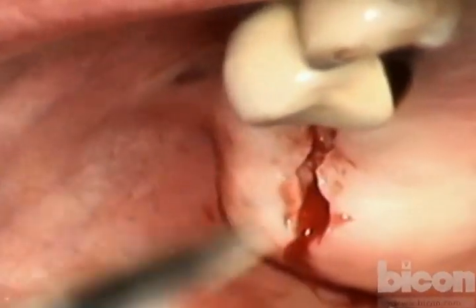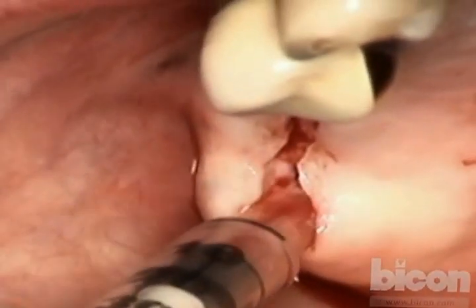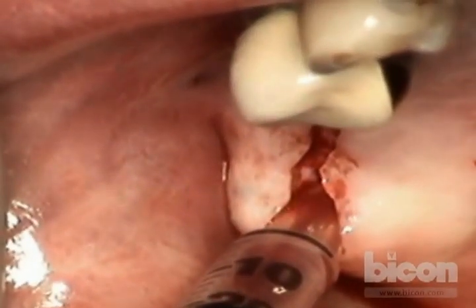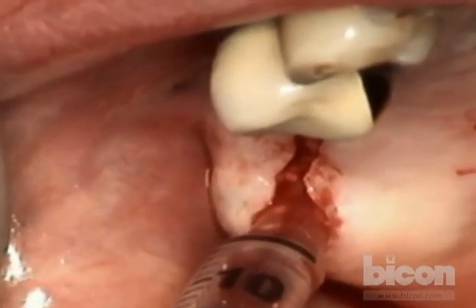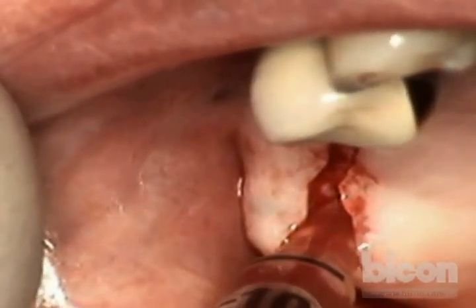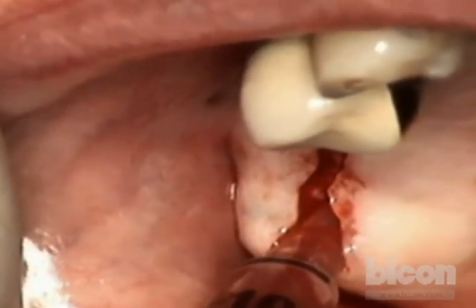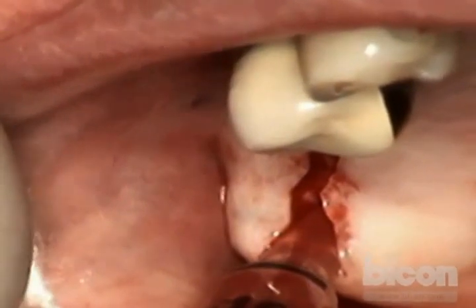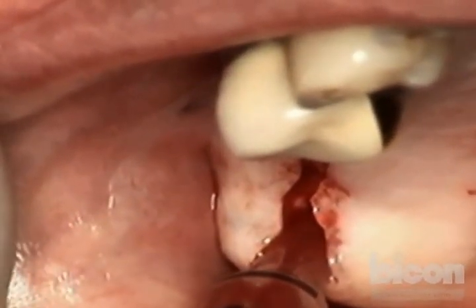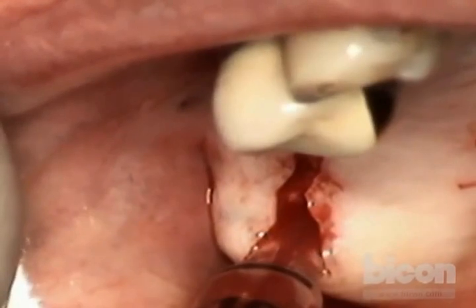Because of the good anesthesia we've obtained, we don't have a lot of bleeding. But we will get enough to get us well moistened. I just draw very slowly, and for a volume of about 1 cc of graft, all we need is about a third to half a cc of blood, or milliliter. And we're getting what we need very easily here.